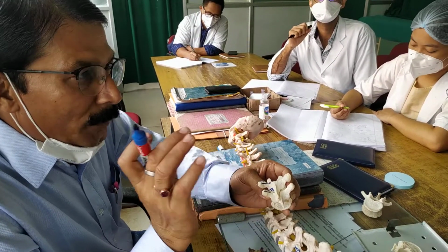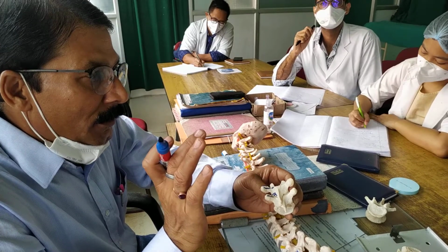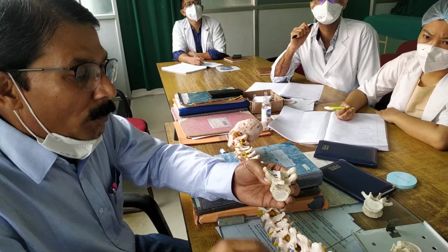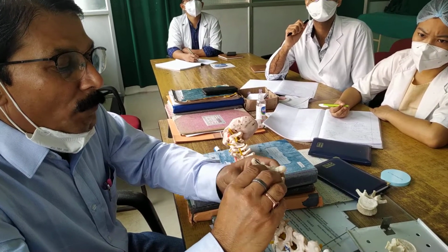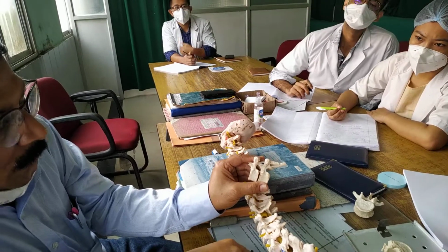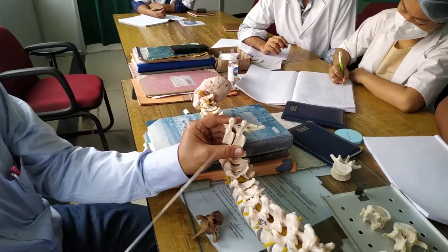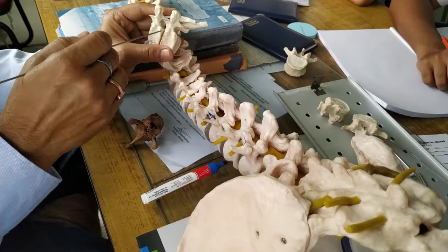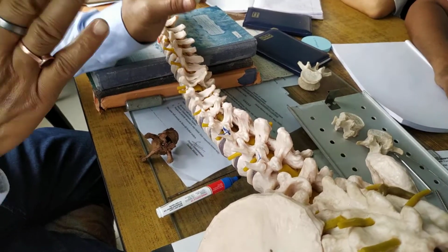Okay? Now what next? Same technique. Now tier 2 to 3 things have already been discussed. I told you that if you look at the orientation of the pedicle, in the case of your lumbar vertebra, the pedicle is almost perpendicular.